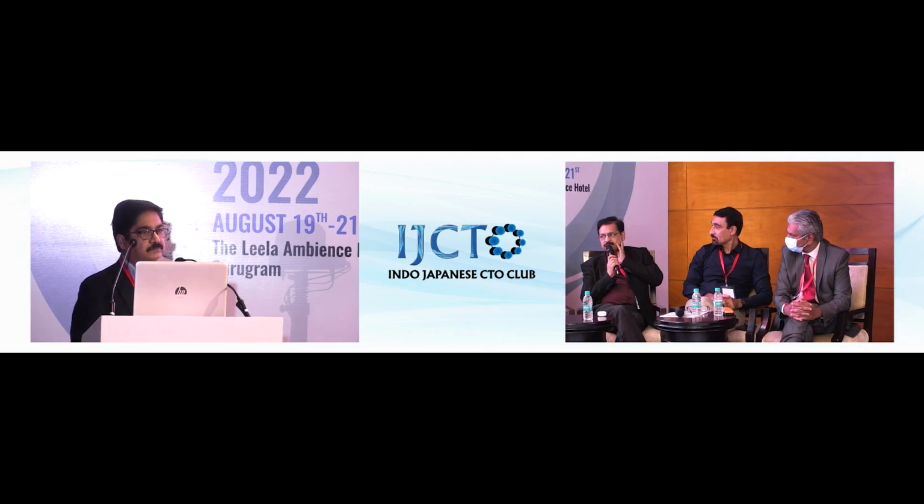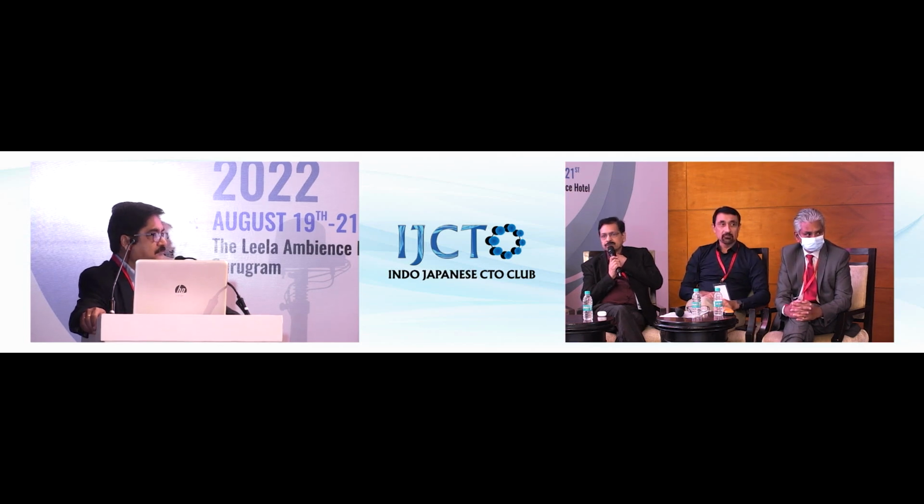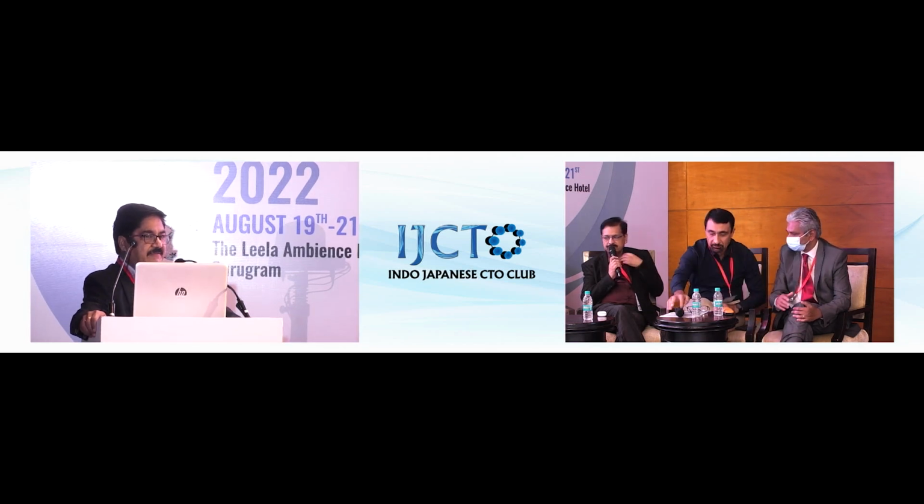Because you see, 85% of the success or failure is the wire cross. That's the basic. And the other issue is that you should agree that the Gaia wire's entry into the market in 2013 or 12, I think, made a big difference in all our antegrade success rates. And third thing is the tactile sensation. Some operators, like Sumitsuji, say there's no importance for the tactile feeling, but I feel the tactile sensation is very important. Feel of the wire is very important. Those are the points I want to make.